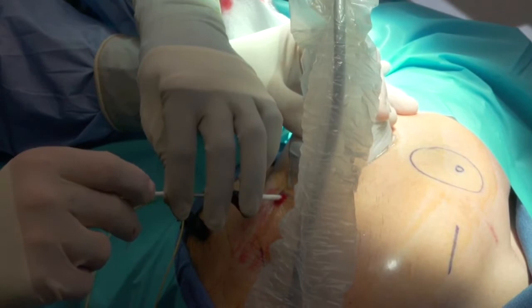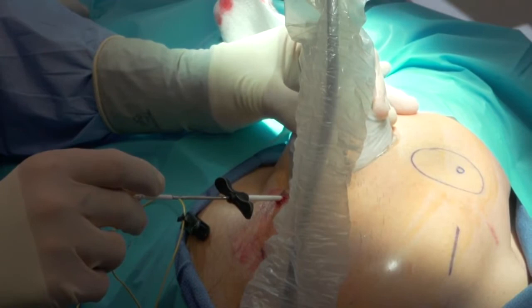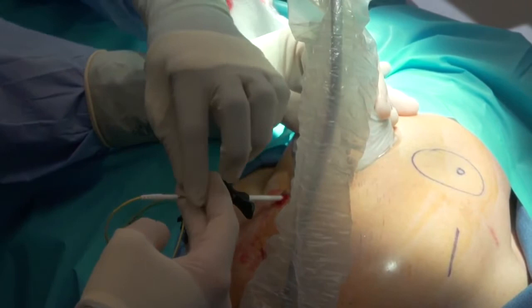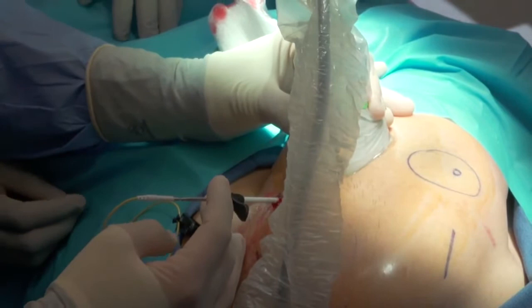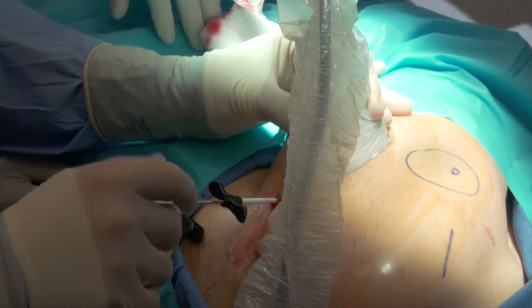I'm going to put the stimulator on again, and we're going to turn that on. Are you feeling anything, Michael or John? No, I can't tell. Okay, because I'm not sure we're connected. So, Michael, why don't you push the white down, this part here? Yep. It must not be out of the machine. Let me pull it out, or advance it, one of the two, but it's not giving me fully connected. We're not getting any numbers, so we have a disconnect here somehow.